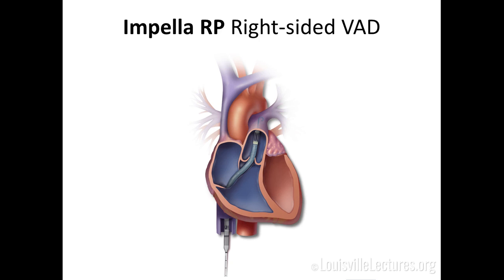A note on these. You should not be putting in any of these temporary devices unless you have an idea about what's the next step, right? So if someone is end-stage heart failure, this is not the device that helps you. If they're end-stage heart failure waiting for a heart transplant, okay, now I have somewhere that I'm going. Or if this is an MI complicated by cardiogenic shock and I'm hoping the myocardium is going to recover, then I can do these devices. But these are not to be used for people who there is no next step for them because this is all temporary. I should also mention the Impella costs $25,000 a pop. So again, you don't just want to be throwing these in willy-nilly.